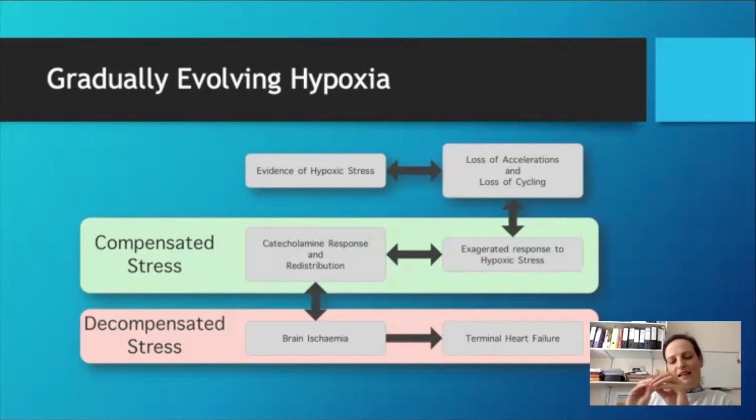So this is the fine tuning of STAN. Most of the time we will be working to avoid STAN events and to manage labor and hypoxic stress in a way that we always have safe babies.